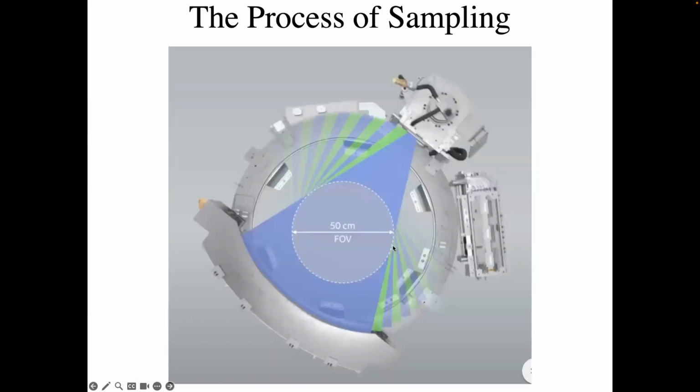Okay. So here's a modern CT scanner, with the X-ray source here. We get a fan beam coming out, and again, it has fan beams in two directions, both in theta and in Z, right? There's a sweet spot inside the scanner. Anything in here can get imaged. And then there's about 892 detectors in this direction, and that whole thing is going to rotate around. So we'll get projections with that type of sampling.